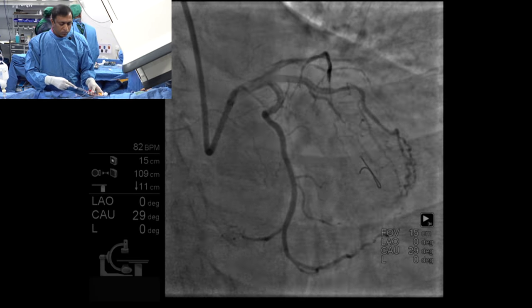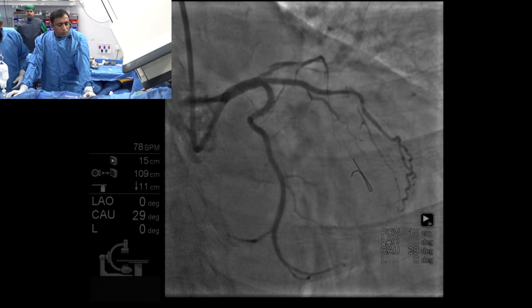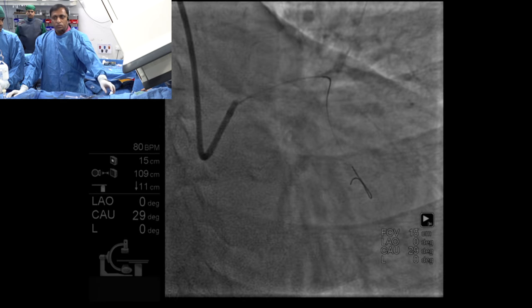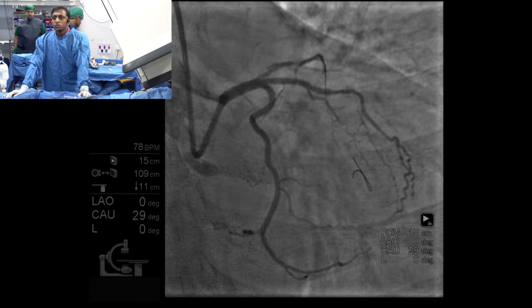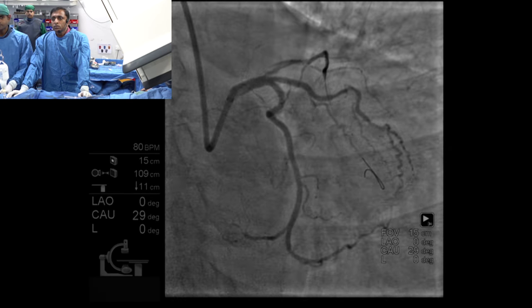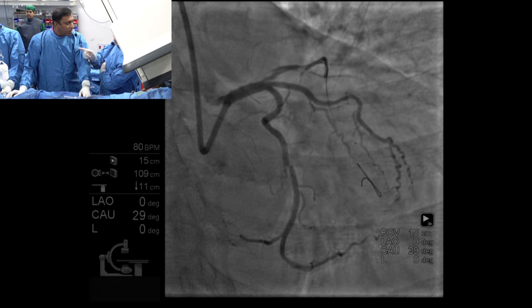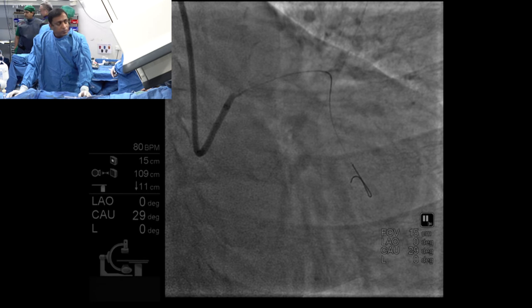We've abandoned the XT and we're going right to Pilot 200 or Gladius as the first wire and then escalating to a stiff tapered wire, again only when there's a very short duration to traverse. If it's long, you use the stiff tapered wire, and the examples are Gaia 3rd, Conquest Pro 12, Hornet 14. There are three to choose from. Pick one and use it. That's then used for just advancing a little ways, and then we advocate de-escalation back to the Gladius or the Pilot 200. In the Progress registry, the most successful crossing wire was the Pilot 200. So there's at least a little evidence that it's a very successful crossing wire.